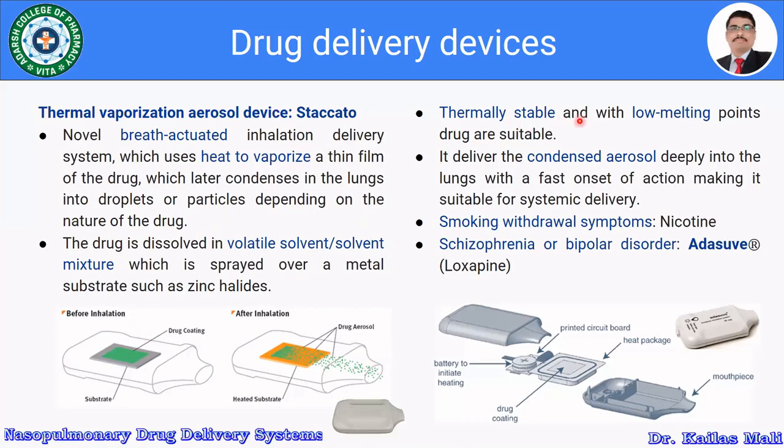Thermally stable drugs with a low melting point are suitable to deliver using the thermal vaporization aerosol device. It delivers the condensed aerosol deeply into the lungs with a fast onset of action, making it suitable for systemic delivery.